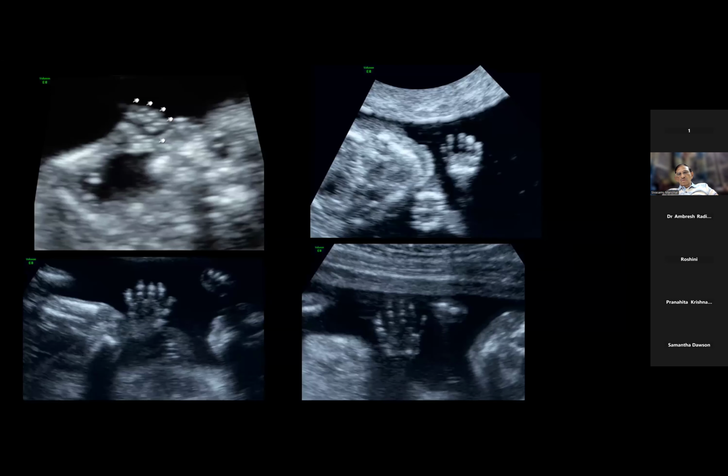Okay. There is one question from Dr. Vijay Kumar, who has asked: are there any clues or conditions where we need to do extensive scanning of limbs, and is there any protocol for extensive examination of the limbs, sir? Yes, there are definitely clues which would warrant us to look at the limbs, toes and fingers. For example, in a case where there is a lateral shadowing sign in the skull, when we take the BPD, that will be the first one to alert us to the possibility of Apert syndrome, the lateral shadowing skull sign.